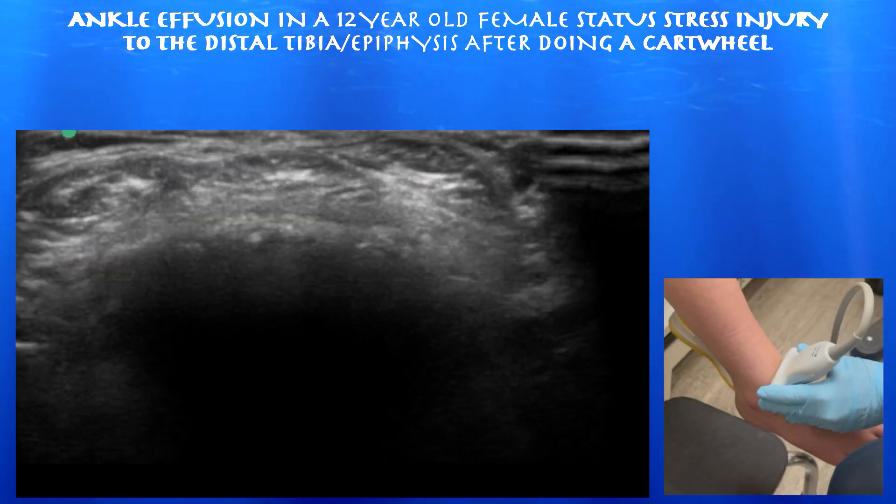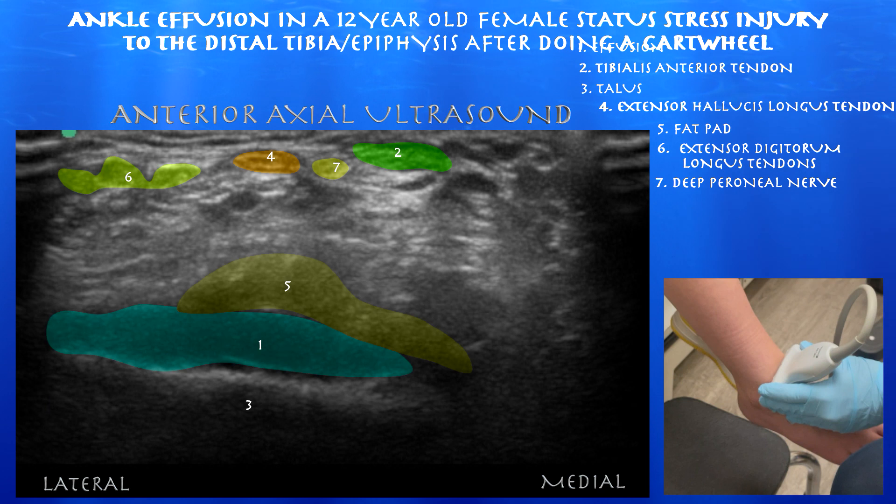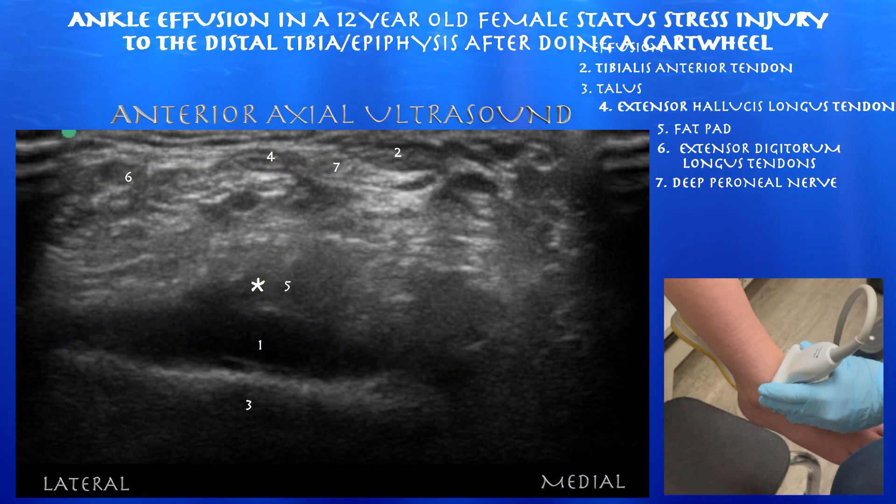And now we're going to look at the ankle joint in an axial view. We just saw the tibia and now we're looking at the talar dome. We can see this fairly sizable effusion again pushing up that fat pad.